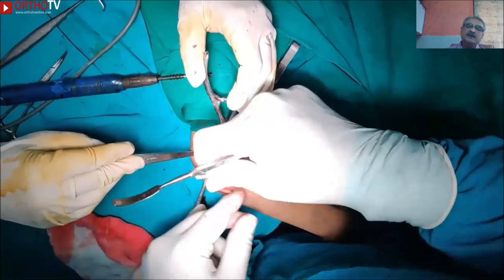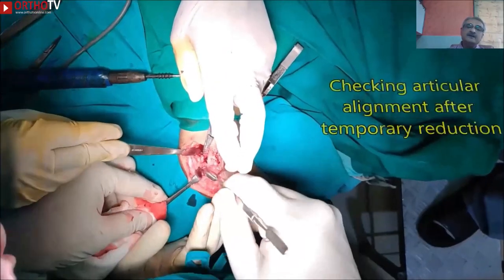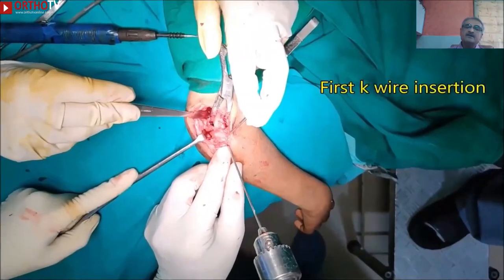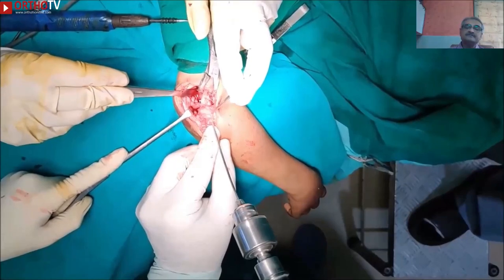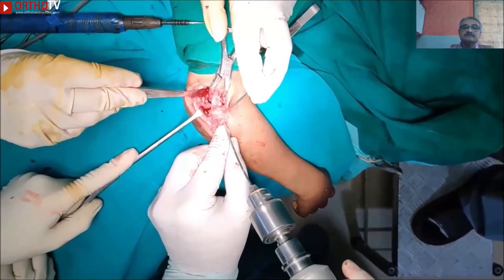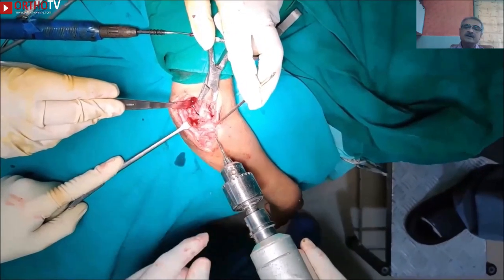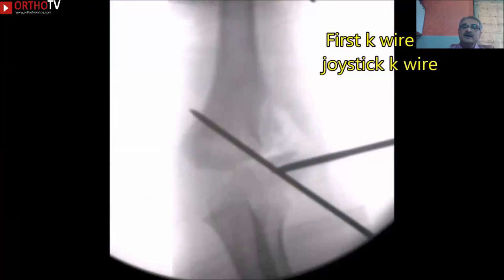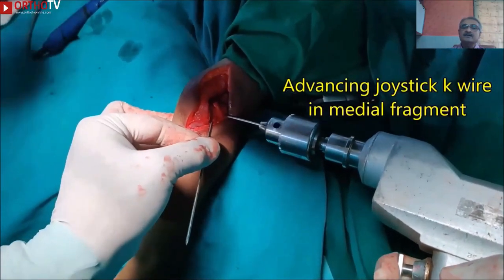Intraarticular alignment check may require some hard retraction of the olecranon which is present on the posterior side. Once a reasonably good articular alignment is achieved and visualized by placing a neurovascular forceps, the first fixation is done by a K-wire starting from the articular part of the fragment. Once bicortical fixation is achieved, the drill is removed and IITV check is done. The joystick K-wire should then be advanced into the medial condylar fragment to give extra fixation.